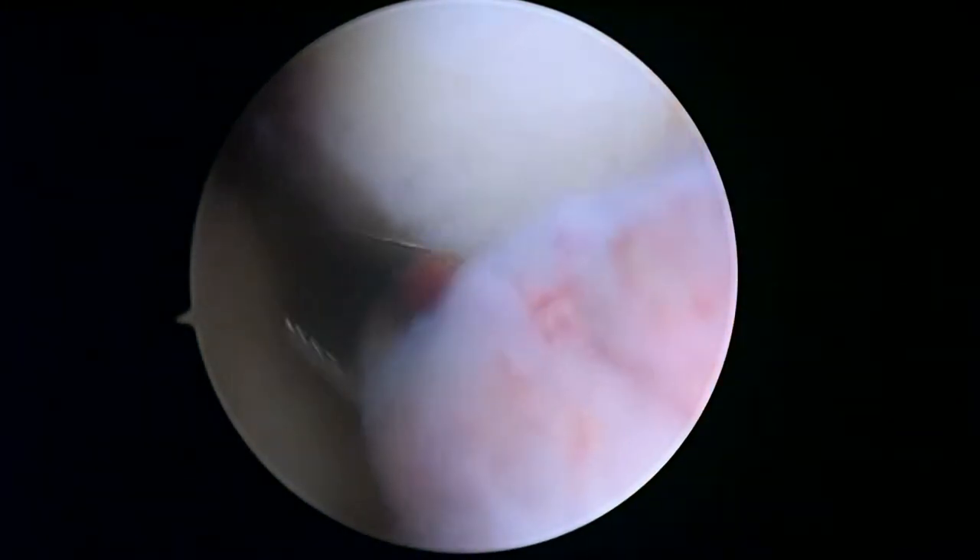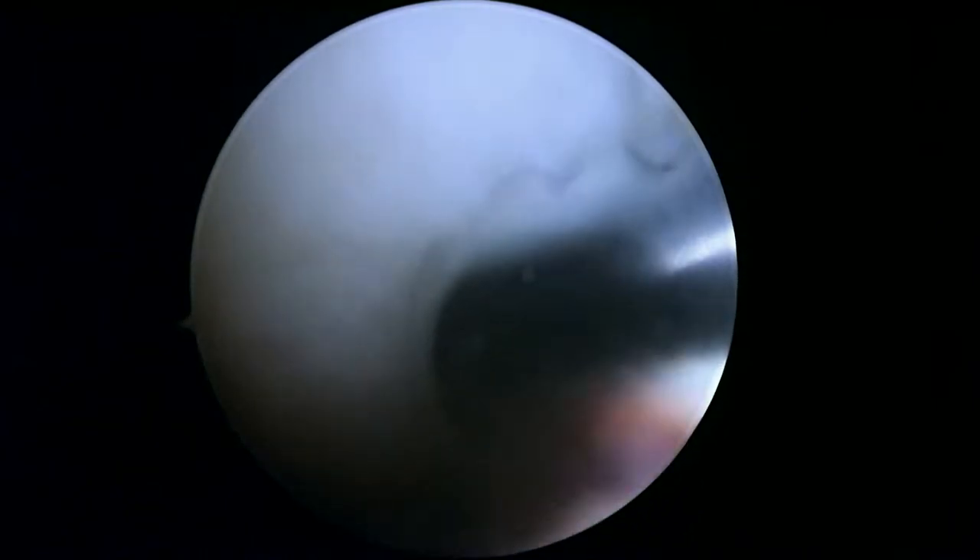The articular surfaces are a different story. You can see some changes on the femoral condyle up above here. Right here you can see where the cartilage is a little bit roughened up and not smooth anymore. We're just going to work on the margins to make sure there's nothing loose.